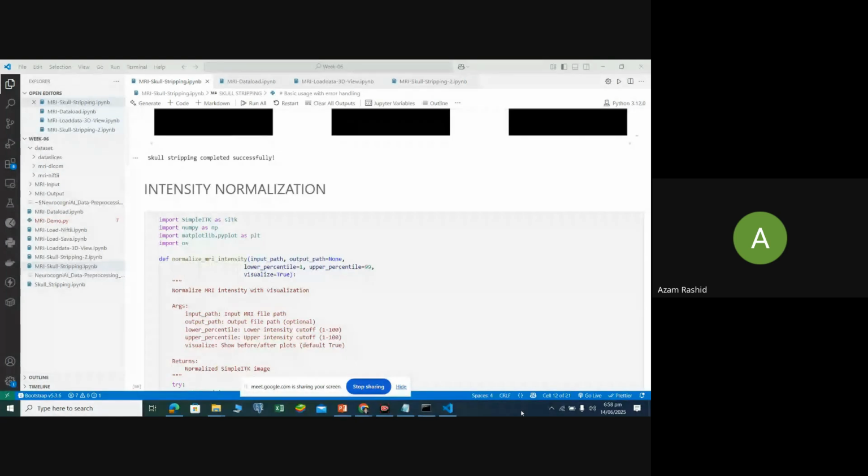In a normal case you predict that the person has Alzheimer's, but you do not know the understanding behind the images. When our model gives the report to the doctor, the doctor checks more than 20-25 slices in better view, and all the slices indicate which area shows mild changes and which area shows early detection. This is the main specialty of our model.